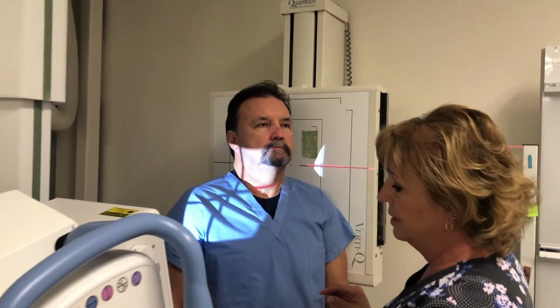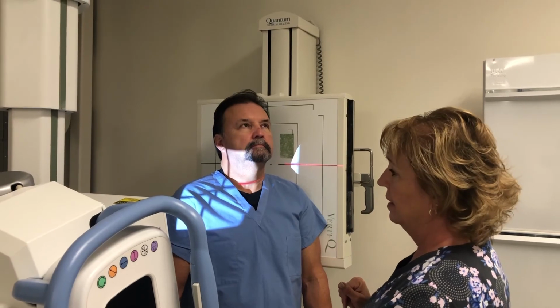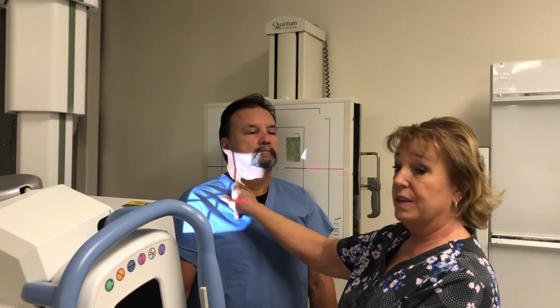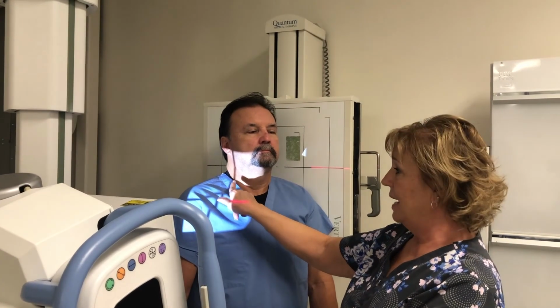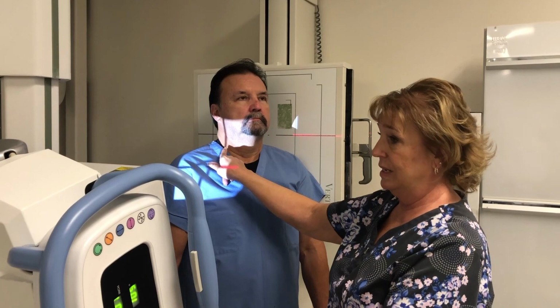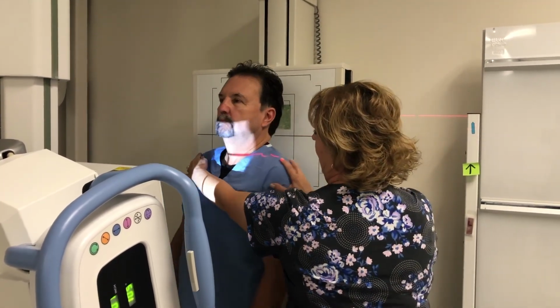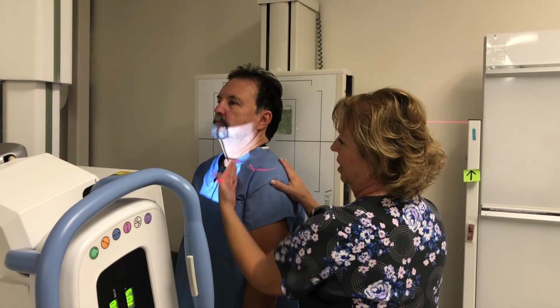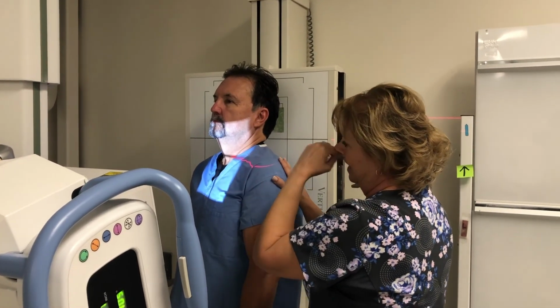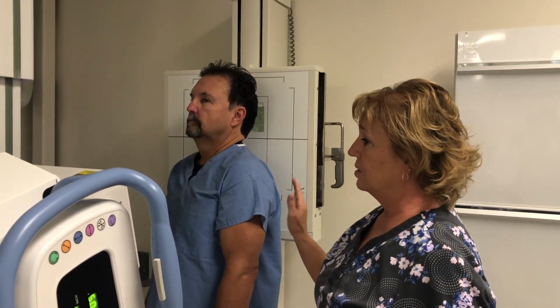I would shield, have him suspend respiration, and expose. And on this one, we are seeing the foramina furthest from the film. In this case, it would be the foramina on the right side of his vertebral column. If I had him in an RPO position, I would be looking at the foramina on the left side of his vertebral column. All right, so that is cervical spine.